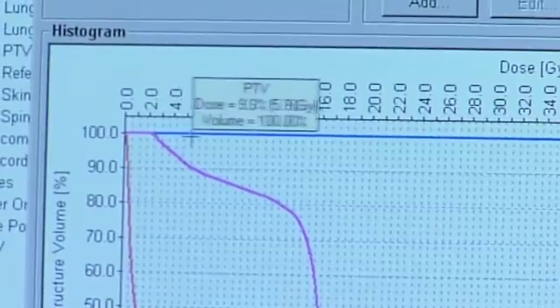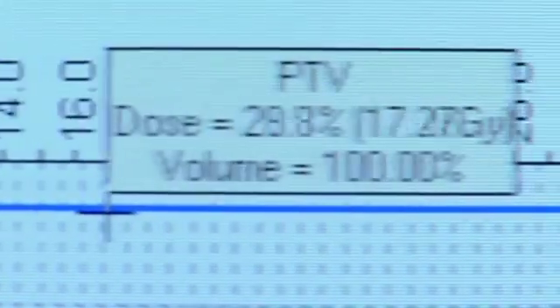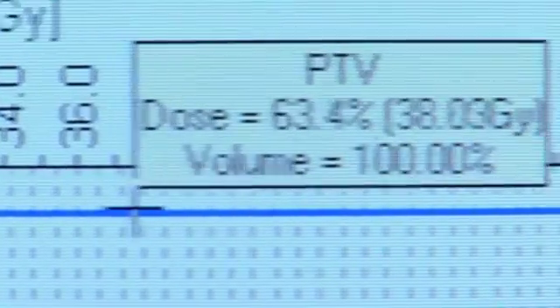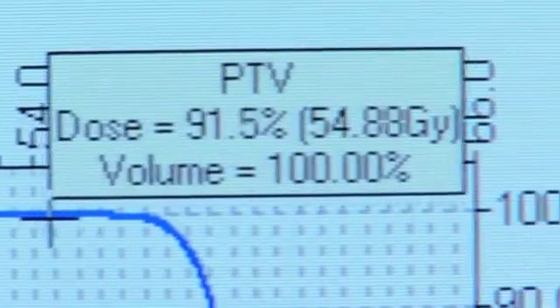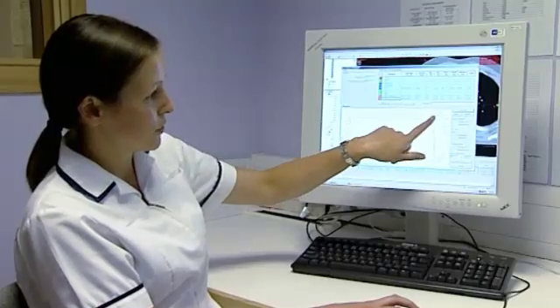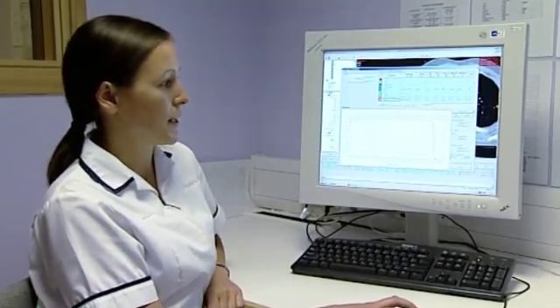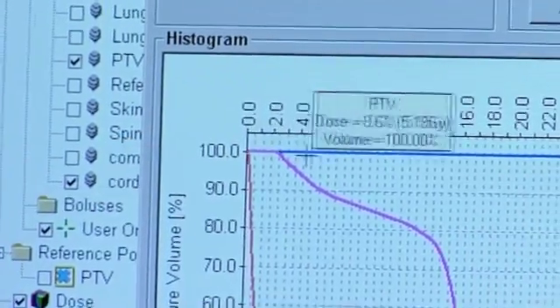This blue line here represents the PTV. And if we go all along the way to the top, we can see that here, 95.6% of a dose is actually received by 100% of the volume.